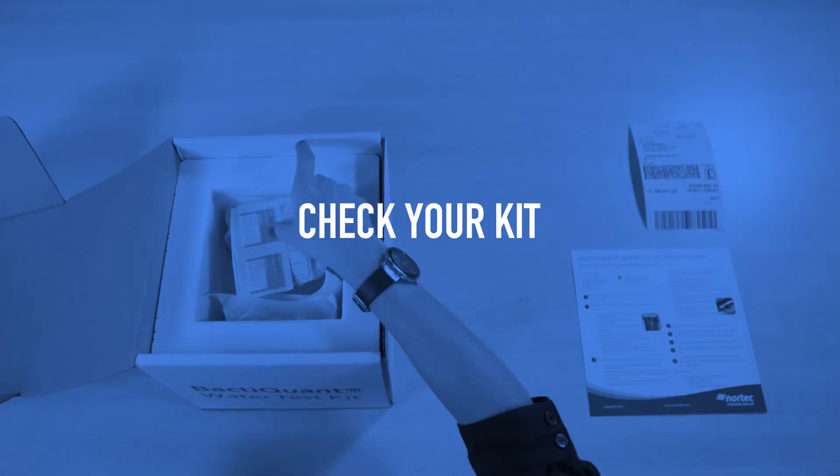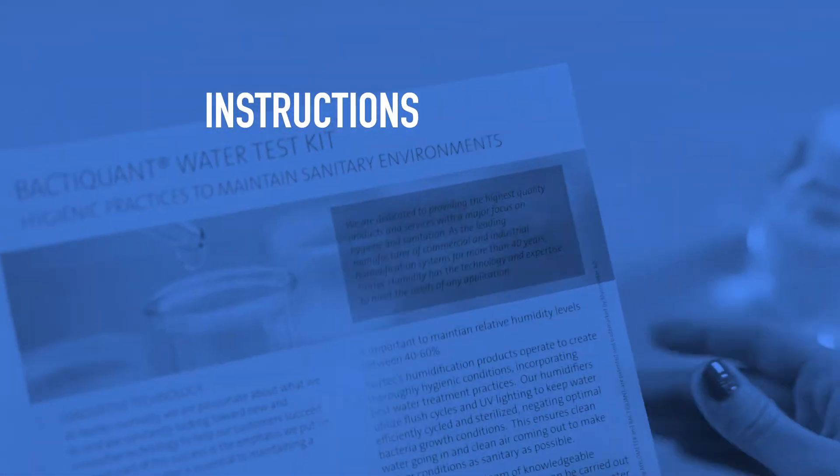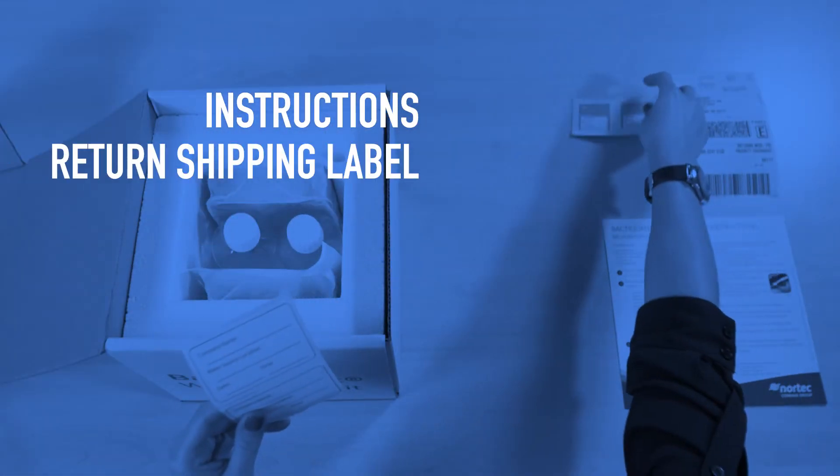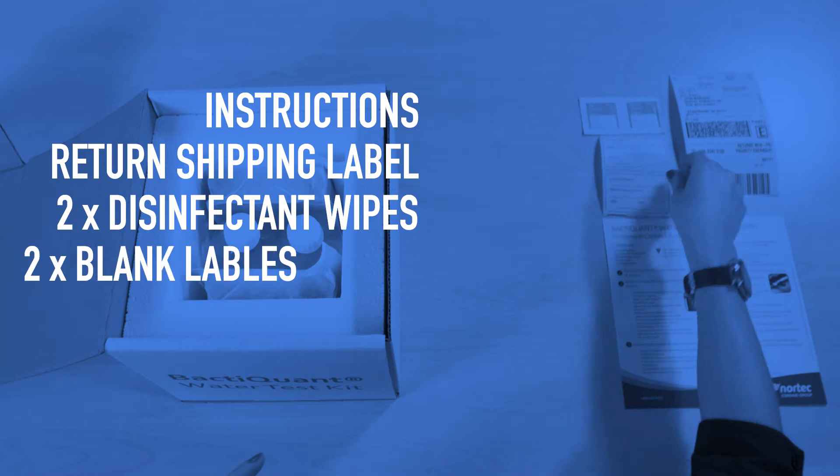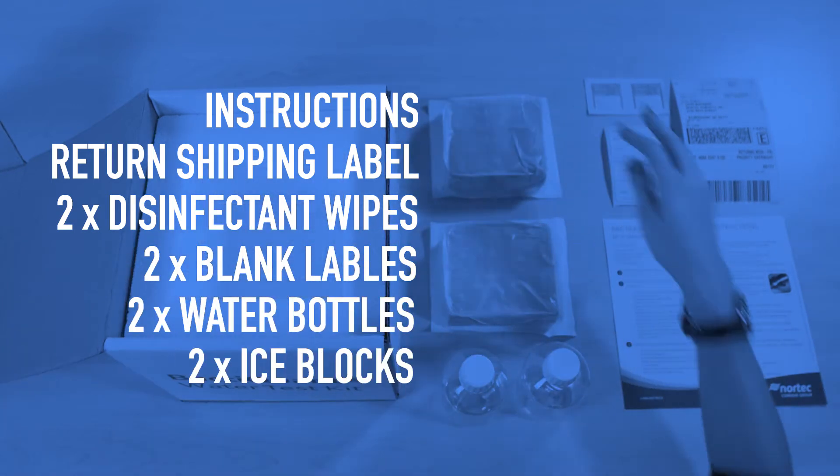Once you receive your test kit, confirm you have all the components. Each kit includes instructions, one return shipping label, two disinfectant wipes, two blank labels, two sterile water bottles, and two ice blocks.